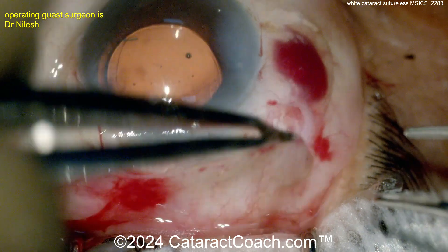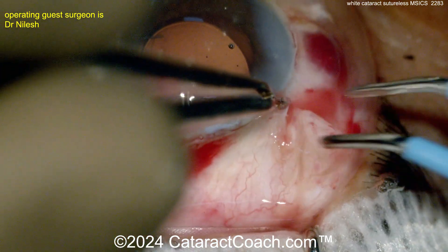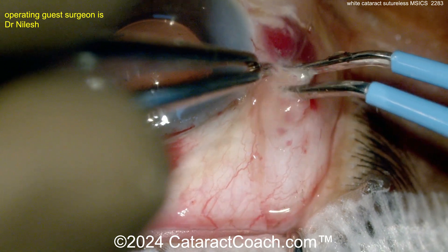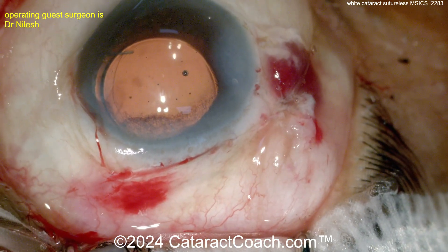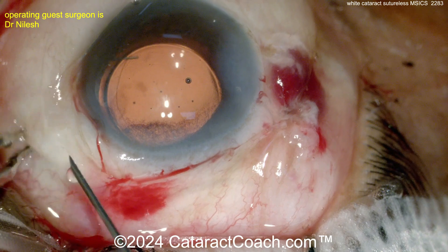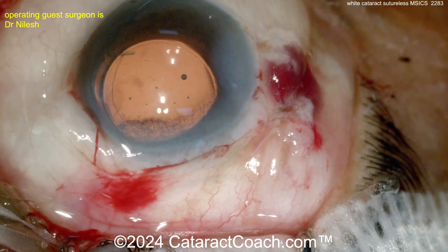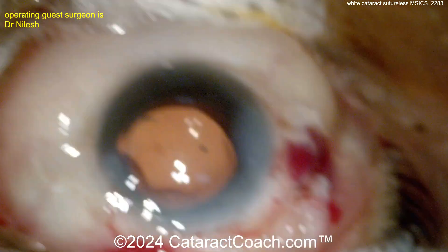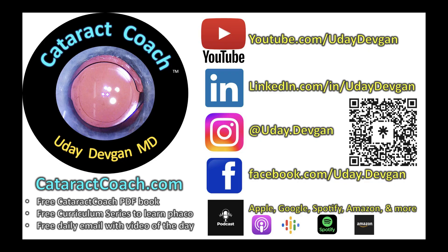At the end, close the conjunctiva with cautery — get a nice closure and protection of that wound. And look at that — done, beautiful! You have to learn MSICS if you're an American surgeon; I promise it's really easy. You can find great videos by searching 'MSICS' on cataractcoach.com.